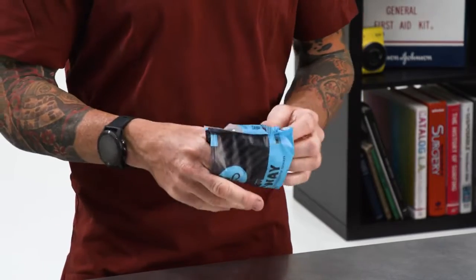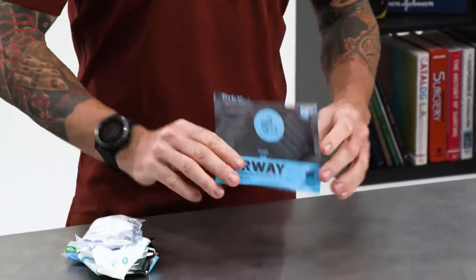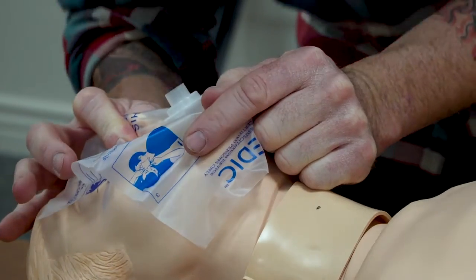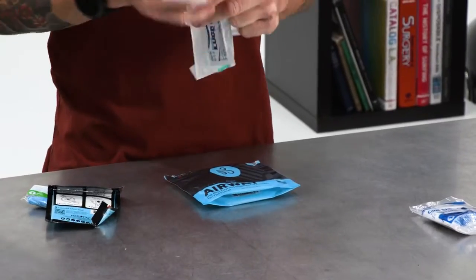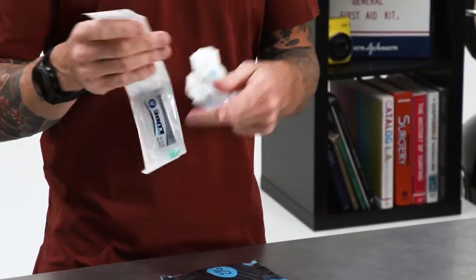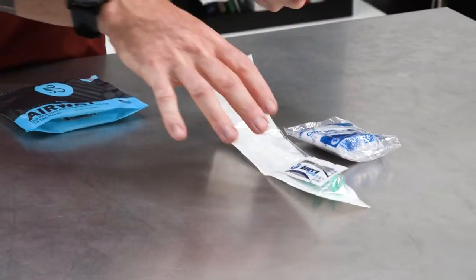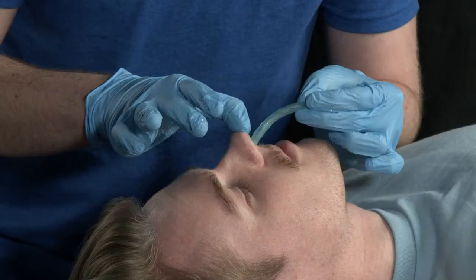Inside you're going to have the basic airway materials. If your patient is having trouble with their airway, these are items to help with that. CPR shield — this is a mask that's going to help protect you if you do have to perform CPR. Two different size NPAs, nasopharyngeal airways — you get a pediatric size and an adult size, both come with lube so you can lube up the NPA before you insert it.